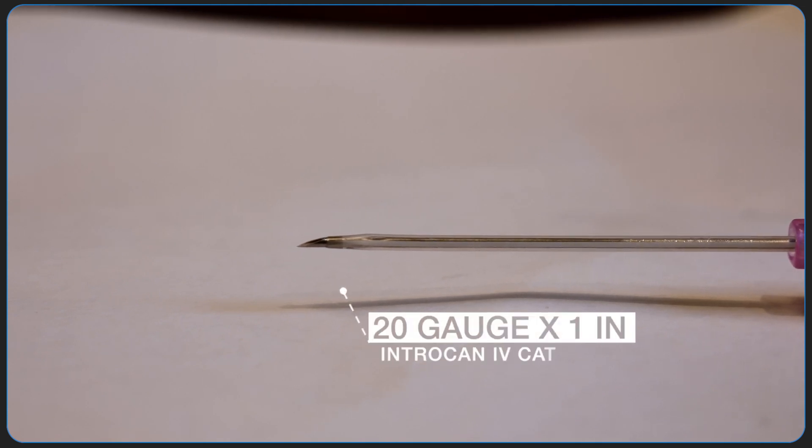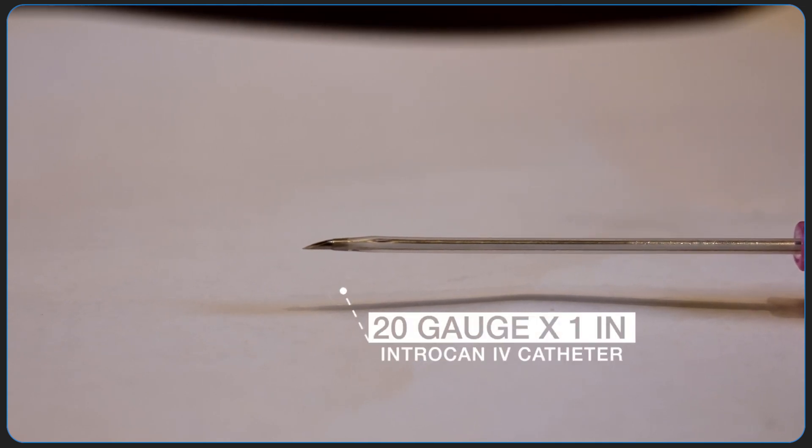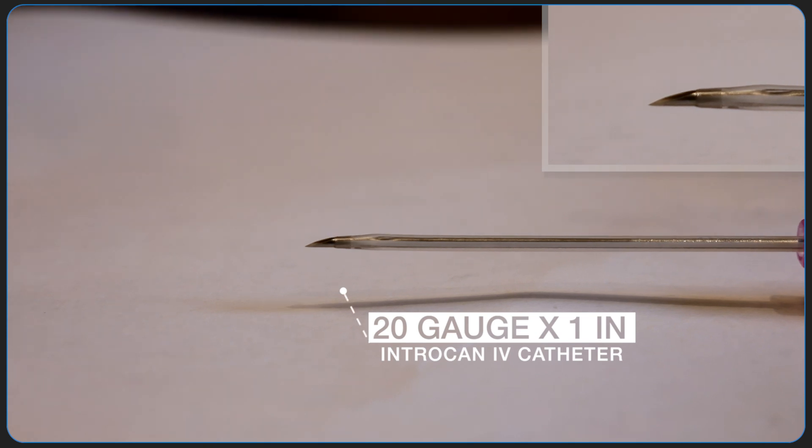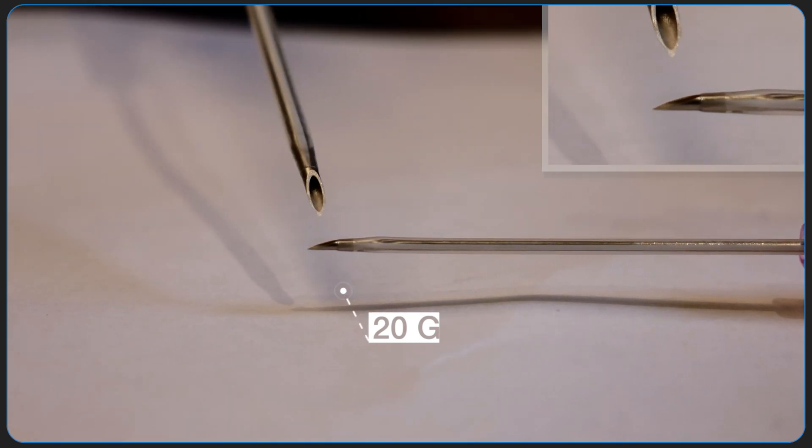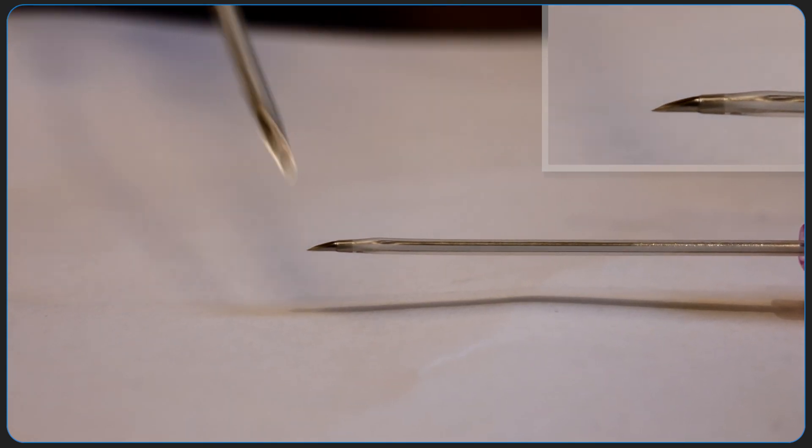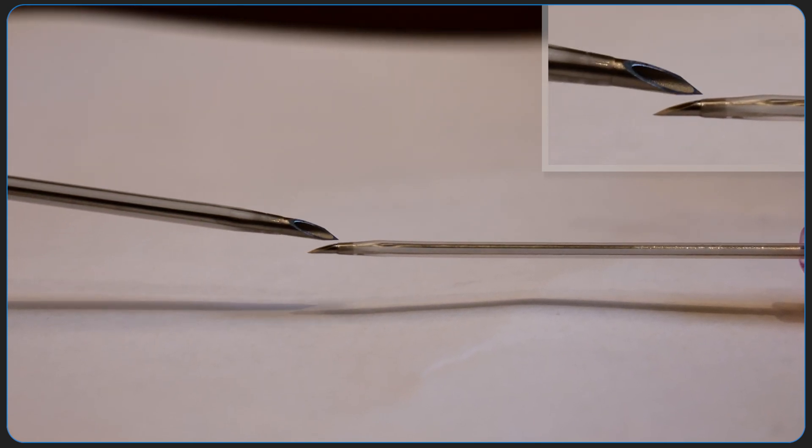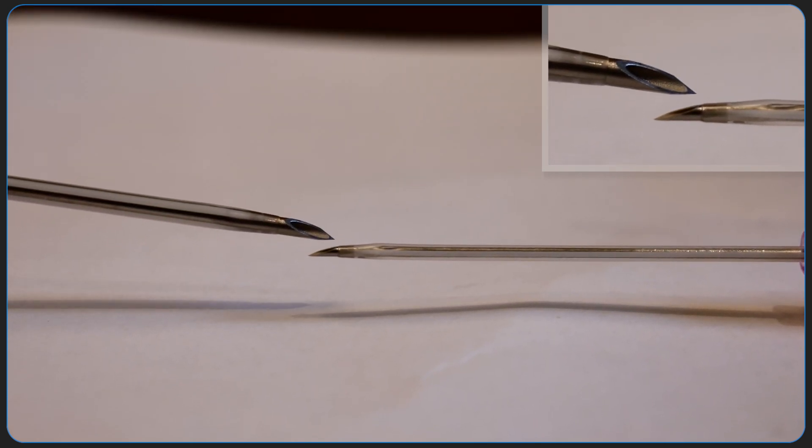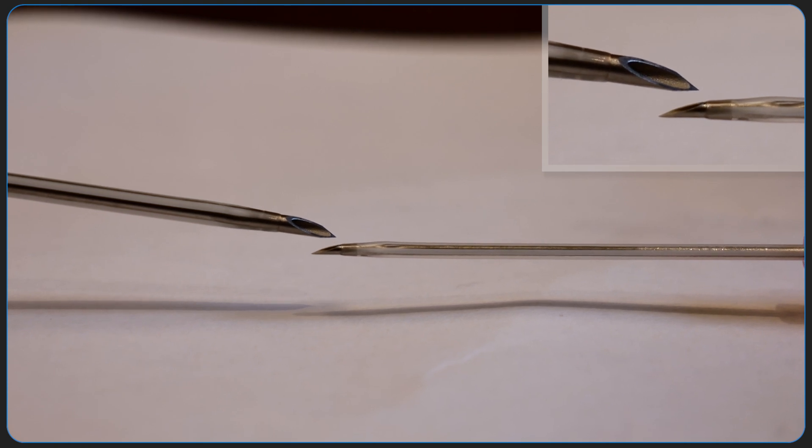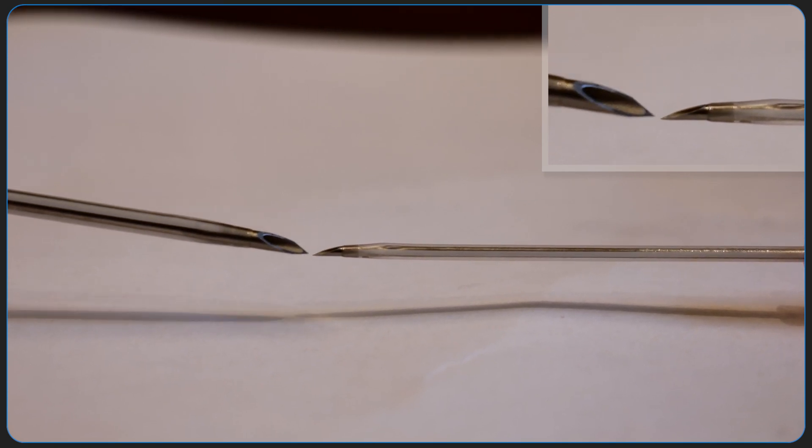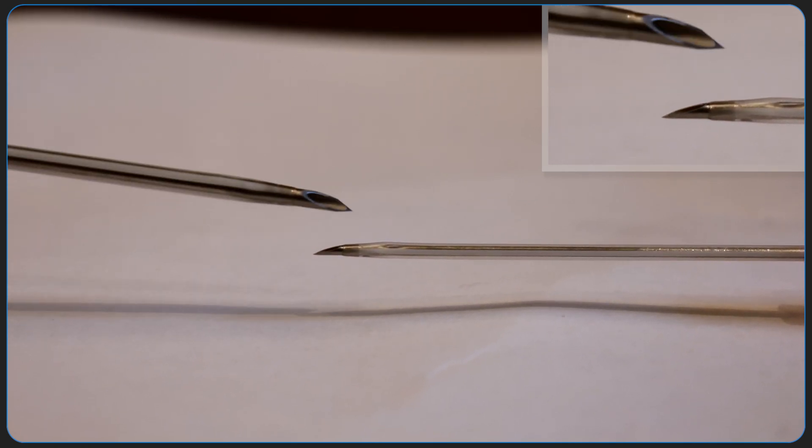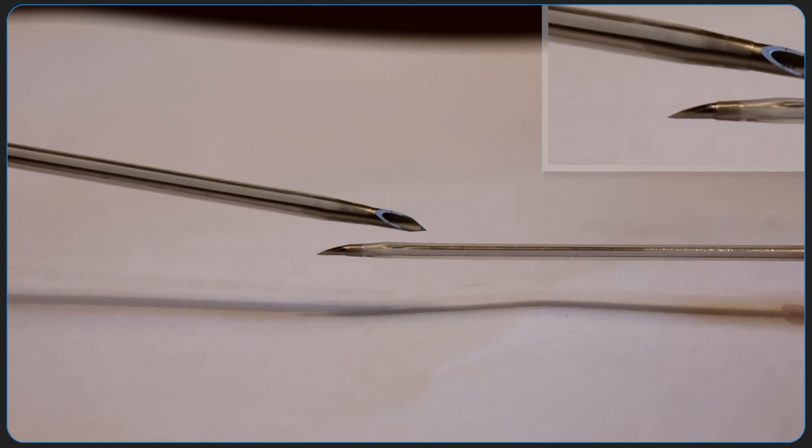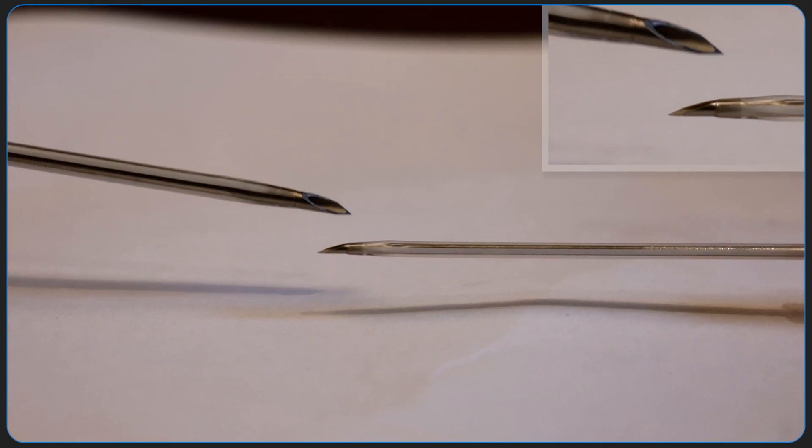It applies less to the little ones, like this 20 gauge. If you look, the bevel here extends only from here to here. Compared to this 16 gauge, it's much smaller. So it's much more forgiving. Because you can advance a little bit more without backwalling. And you don't need to advance very much before you can slide off the catheter.